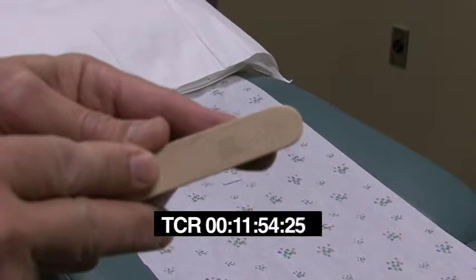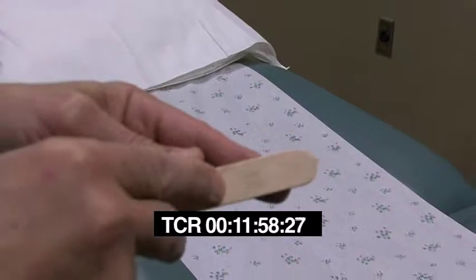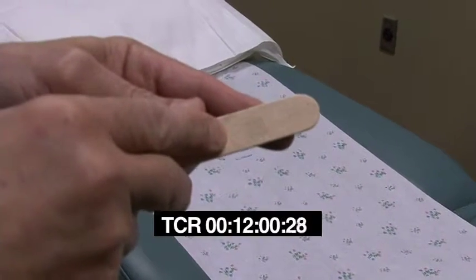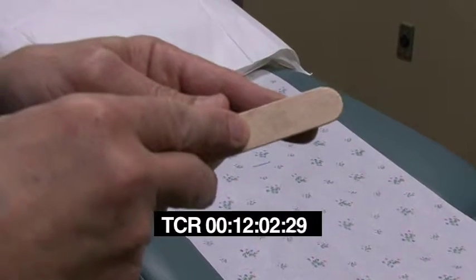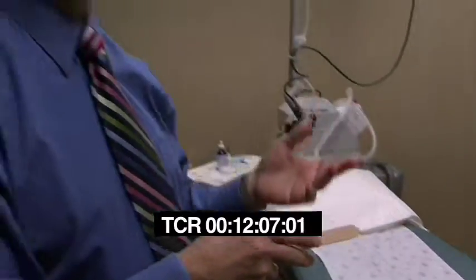So you can see those little dots are the areas that actually penetrate to whatever depth we set the machine at. And between them, there's little skip areas. That allows the skin to heal not only from below, but it allows us to let the skin heal from side to side. So there's a faster healing rate.